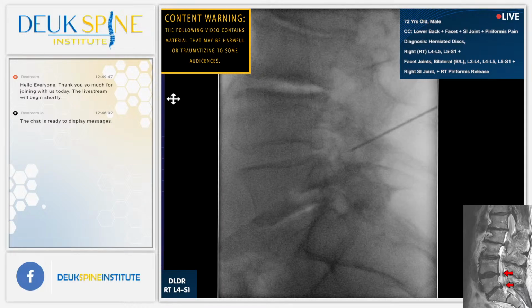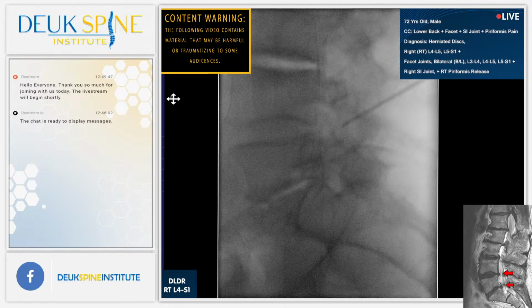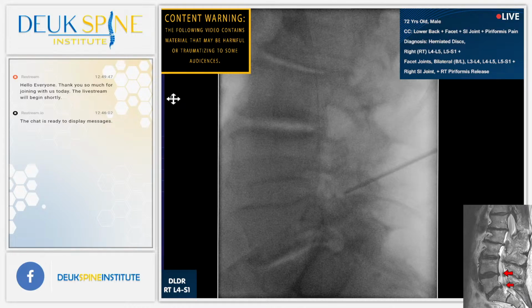Jordan, you're off on the rabbit ears, dude. Come on. You're off on WAG. Your orbit's okay. It's your WAG that's off. Shot? I think that's... I don't know. Does that look better? Try the other way. I think that's worse. Yeah, he's got scoliosis, so you're going to have to accommodate it.